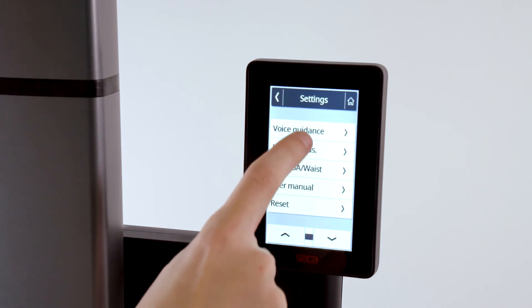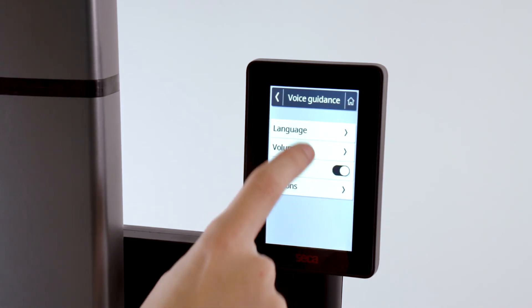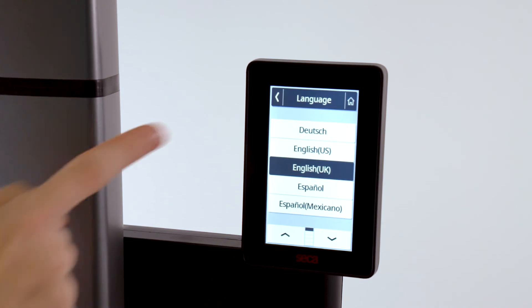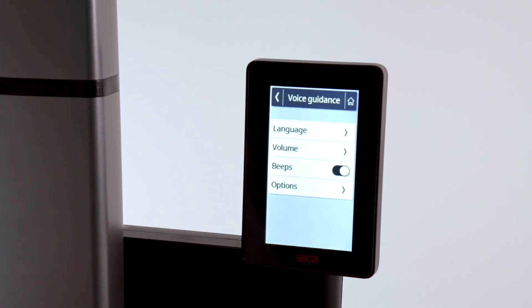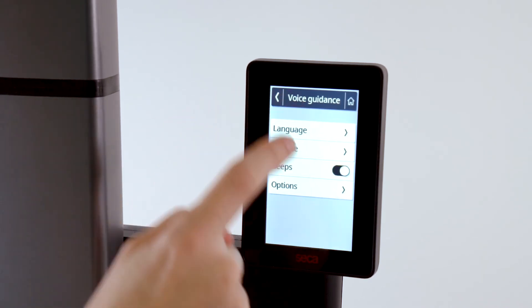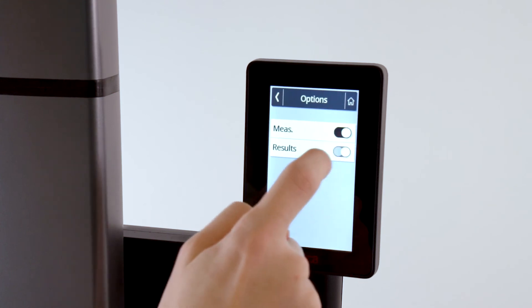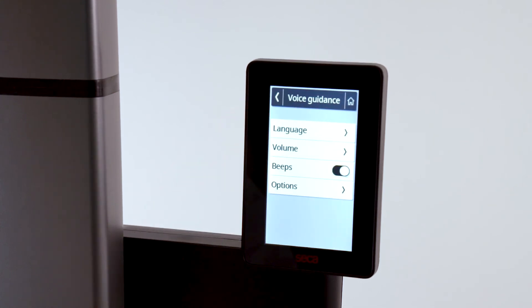Under options, you can control the voice guidance. First, choose the appropriate language for the voice guidance. For privacy reasons, we recommend disabling the voice guidance for the measurement results.